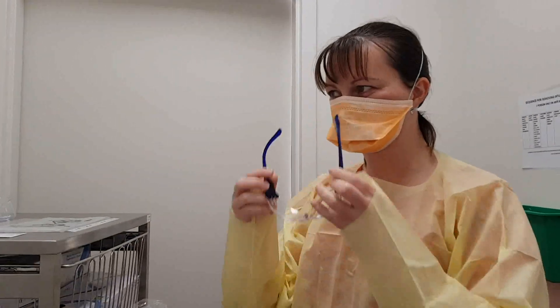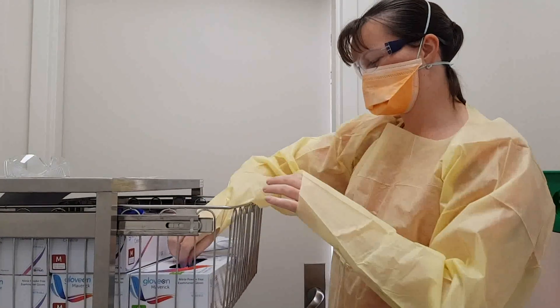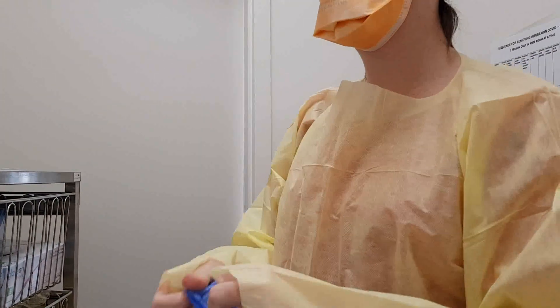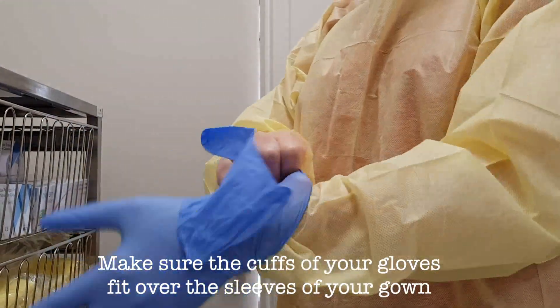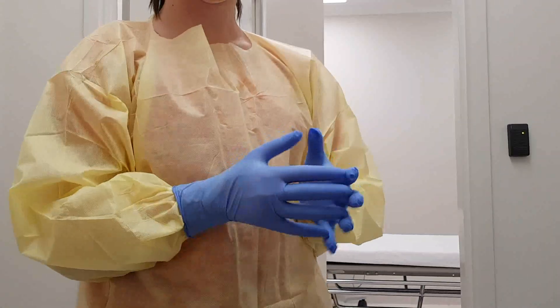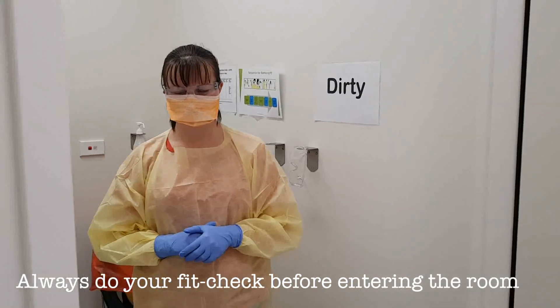Apply your eye protection to sit over your mask. Make sure that you've got correct eye protection if you have prescription glasses. Then finally apply your gloves, making sure that your glove cuff sits up over the sleeve of the gown. Always remember to do your fit check before you enter the room.